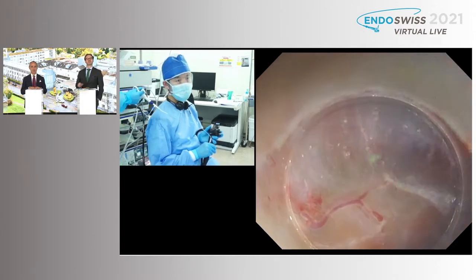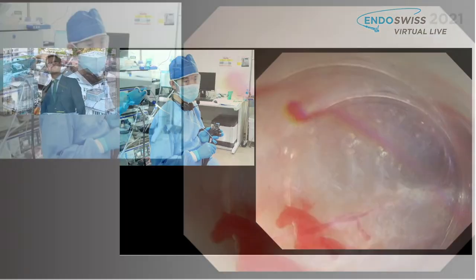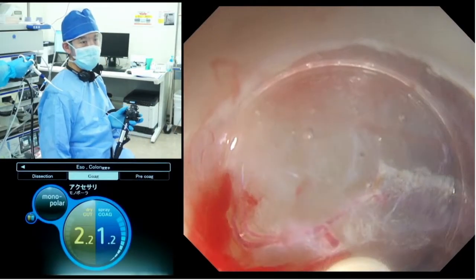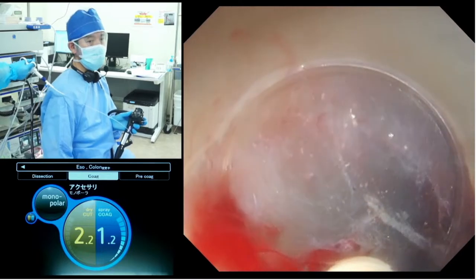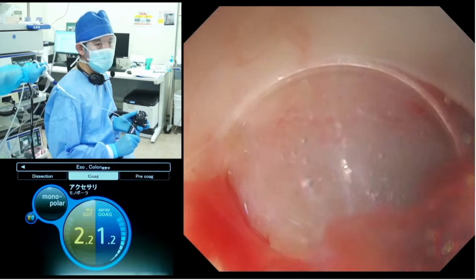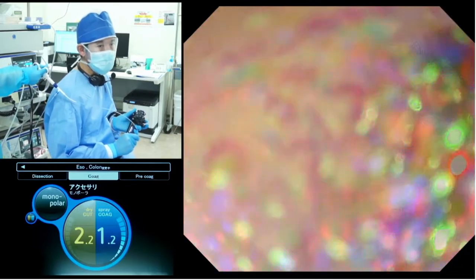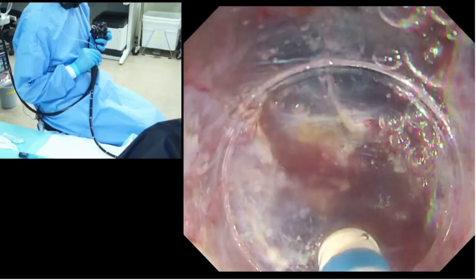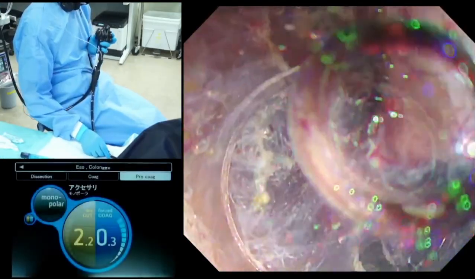In case of having minor bleeding like this, we can easily stop it by applying the close tip of the dual knife. In this situation, we usually use spray coagulation 1.2, which is usually good enough to stop this kind of minor bleeding.